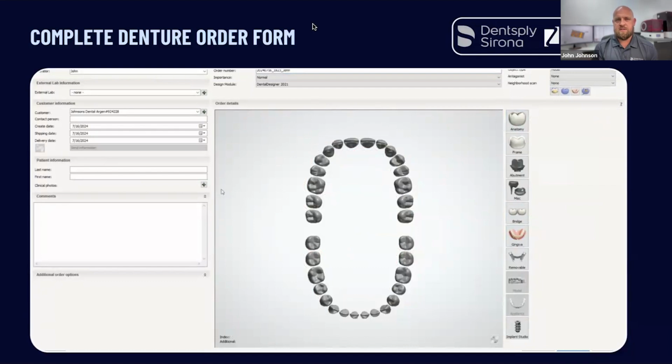And then you also have to tell it exactly which material you would like to use, because that's built into the software and built into the outputs. And then I'll let it get back to it.